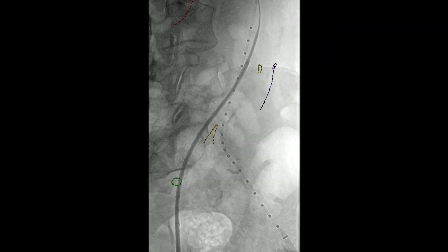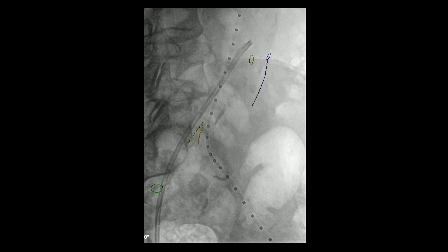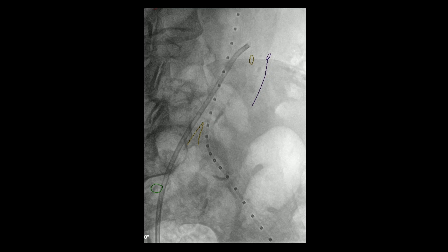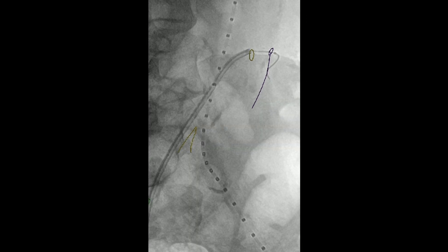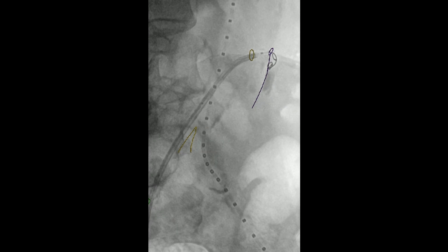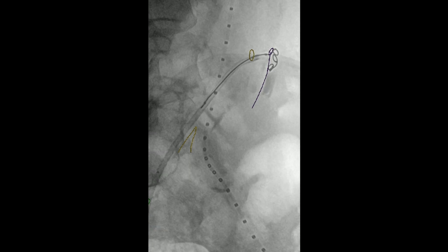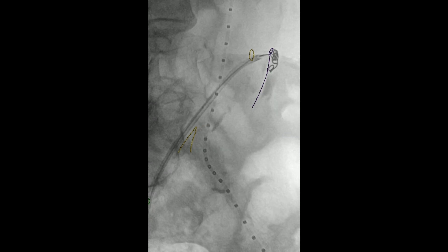The initial plan after fusing the CT scan to the patient was to embolize the IMA preemptively. The yellow circle represents the origin of the IMA, and the purple line shows the stem of the IMA and then the center line. You can see how the catheter passes into this. We actually got a little dissection initially, but went on to embolize this with coils — interlock coils from Boston Scientific.